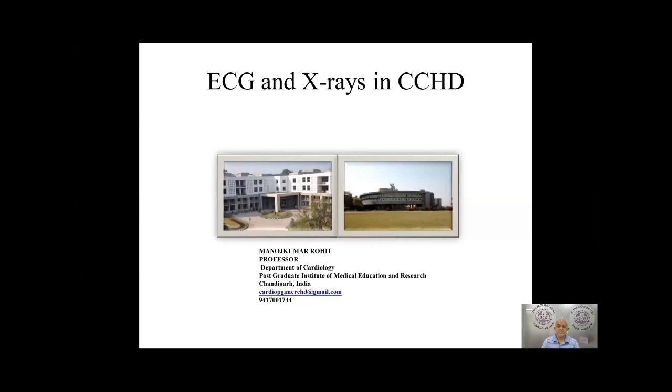Good morning, all of you. It's my great privilege to be part of this important meeting on children with heart disease, and I'd like to thank organizers for giving this opportunity. My first talk is on ECG and X-ray in cyanotic congenital heart disease, which is rather tough to cover in 15 to 20 minutes. But I will try and stimulate all of you that they are forgotten but very useful way to help recognize urgency or diagnose and then refer to appropriate center.